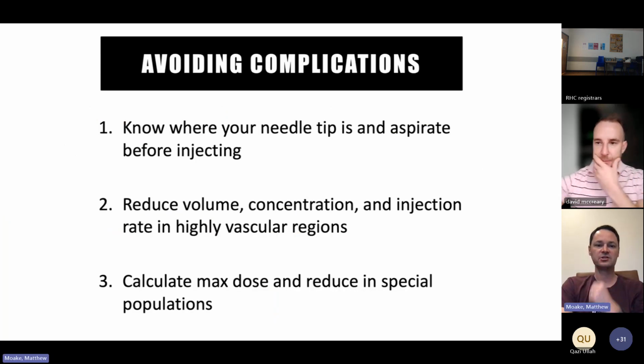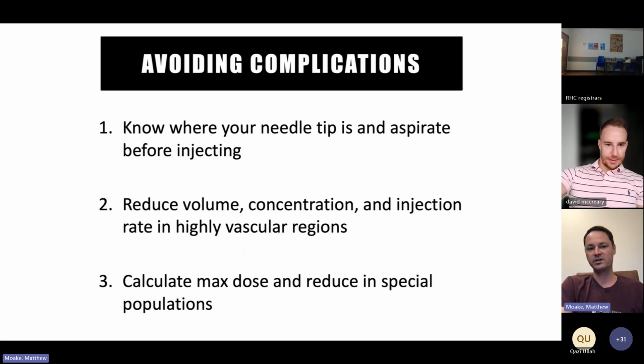Keys to avoiding complications, first and foremost: know what your needle tip is at all times. The benefit of ultrasound guidance, again, is that you should know where your needle is, where you want it to be, and where you don't want it to be. You should still aspirate before you inject, the same way you would if you weren't doing ultrasound guidance.